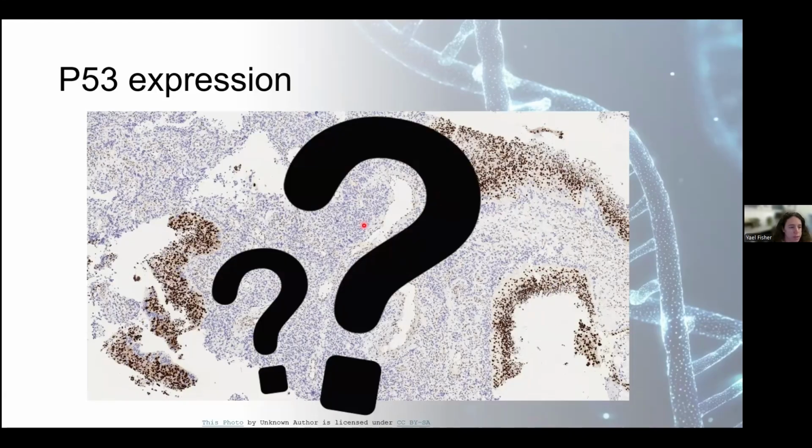So this tumor was sequenced, not only because of the P53. So one idea is heterogeneity of the tumor. That's a good idea. Normal tissue in the background, that might be a good explanation, but both patterns of staining are pathological. One is loss of staining, and one is strong staining. So we can assume that maybe the p53 is mutated in both of these.